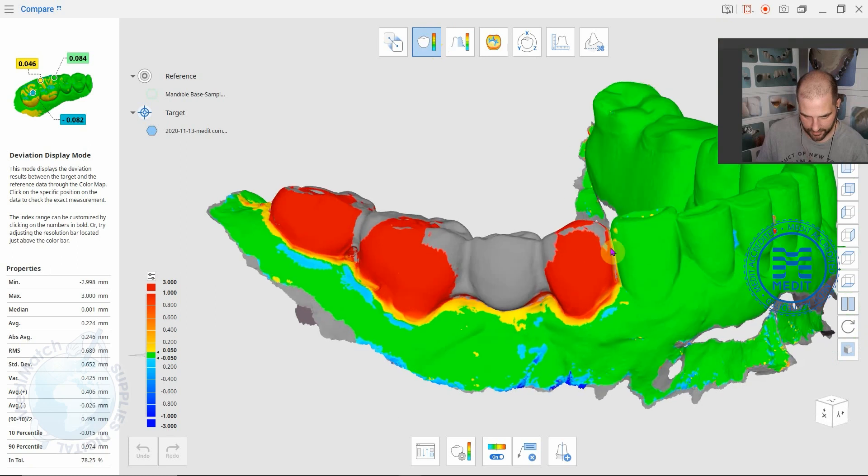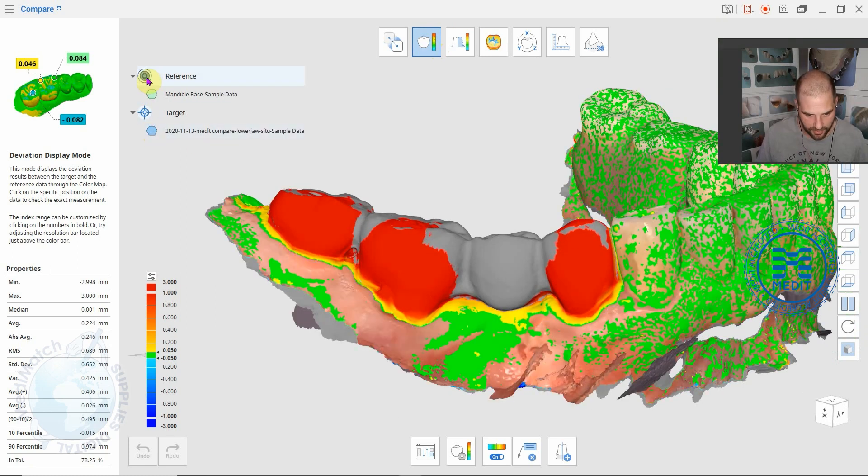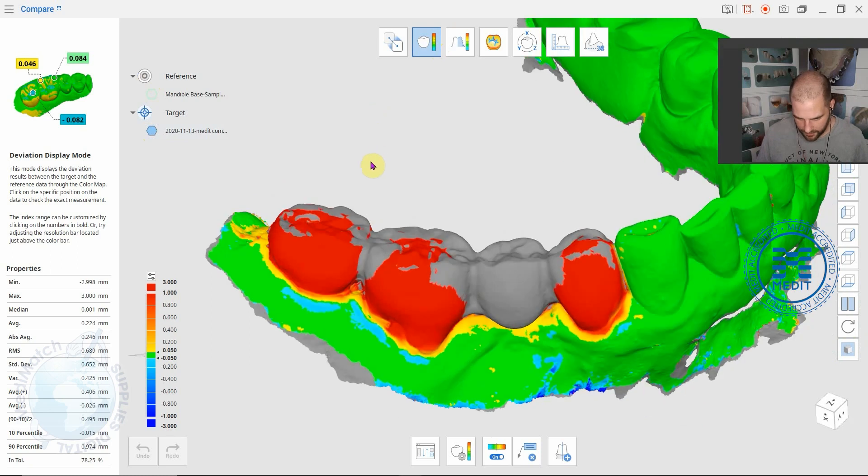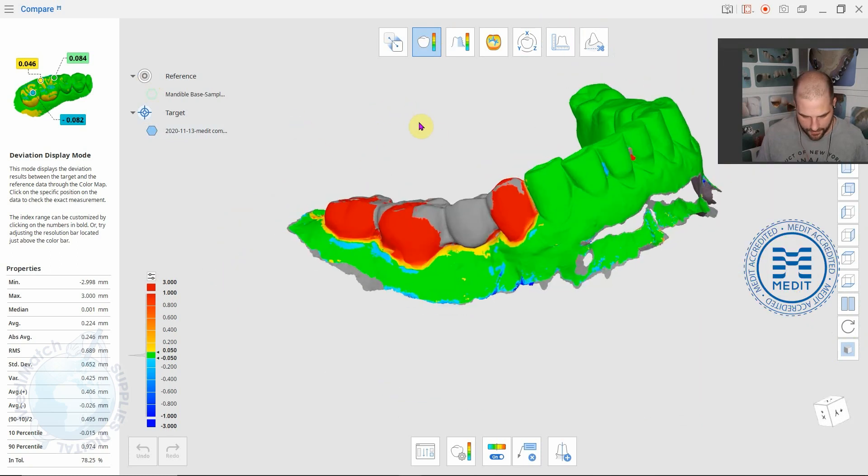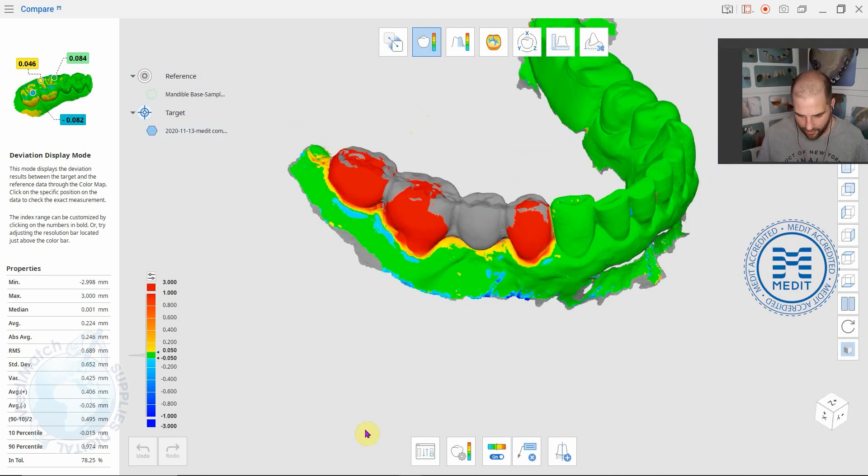You can play with which one's a reference and which one's the target and you can turn each one off up here. That's one option in this compare app.